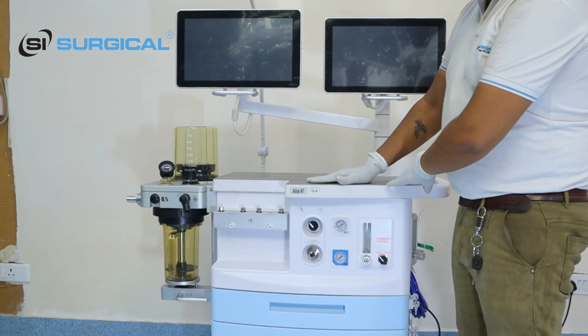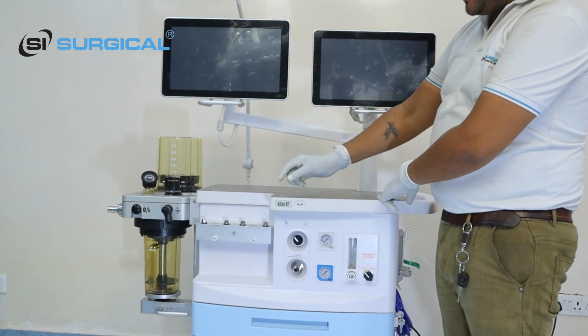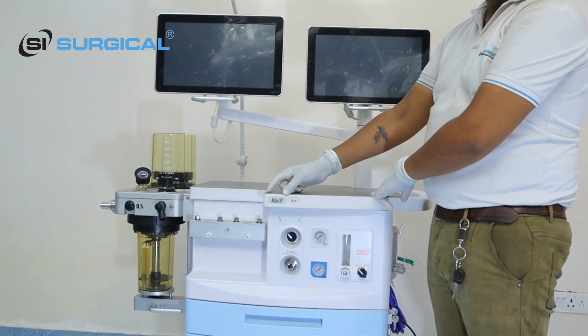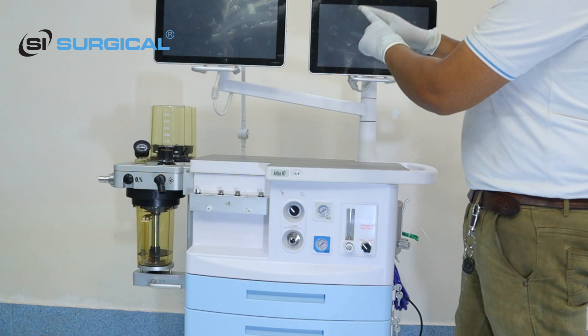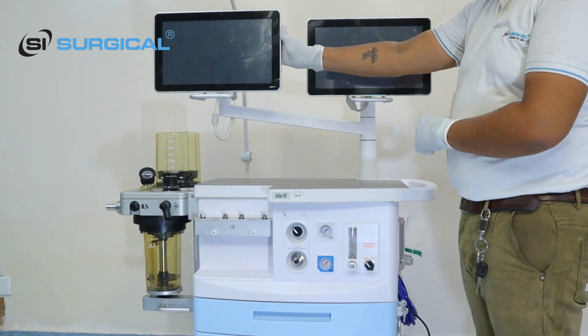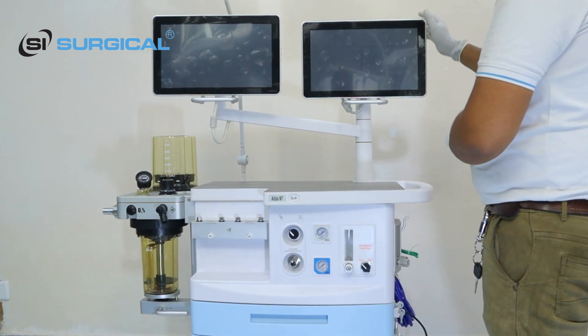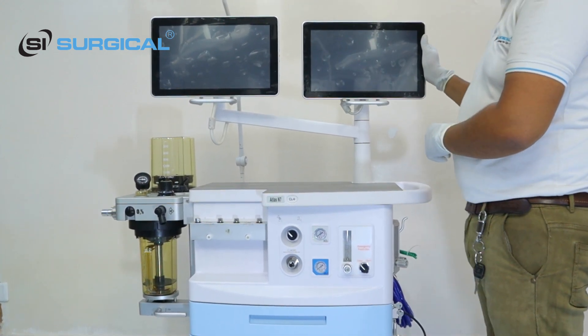Today we are proudly presenting our new product made by Northern Meditech Atlas N7. We have a dual display: this one is for the ventilation or anesthesia system, and this one is for the patient monitoring system.